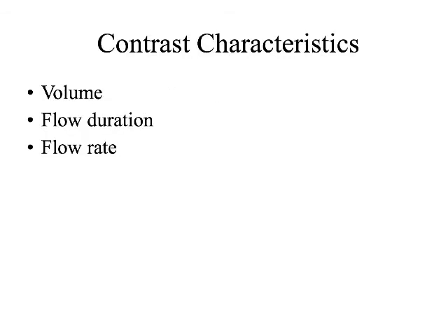So as we're introducing contrast into the system, we are going to have to think about a number of different things. And this is really just a kind of preview of CT type stuff. We think about the amount of contrast we are injecting. And given the amount, we think about how long it will take to do that injection based on how quickly we do the injection, right?